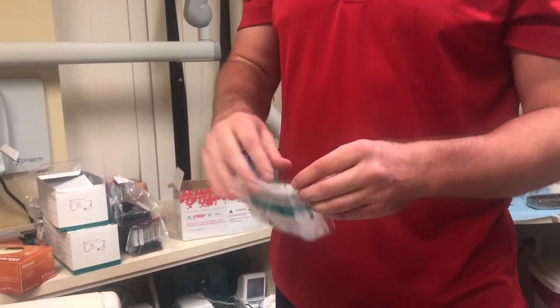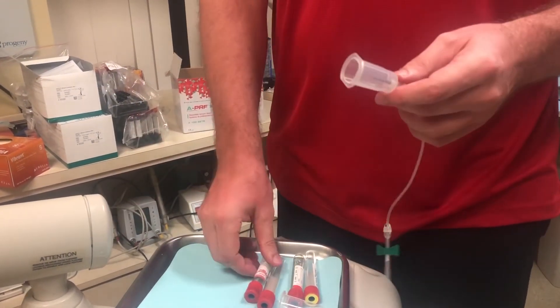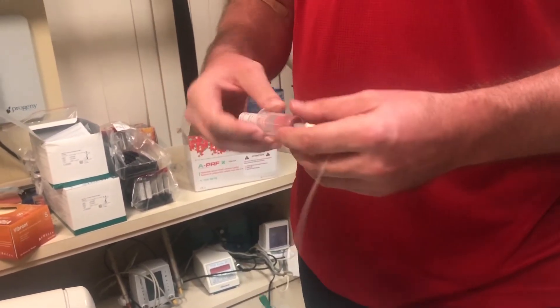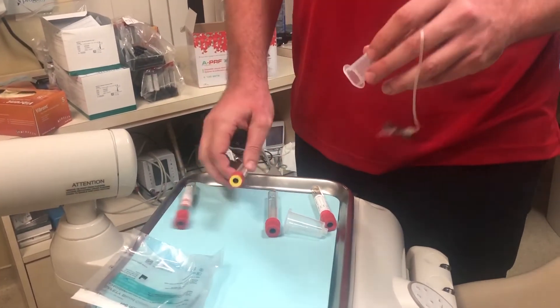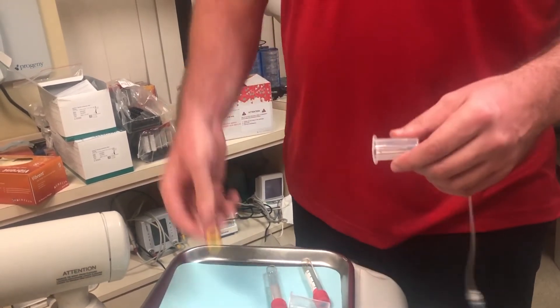These are the standard Vacuette butterfly needles that everybody uses. I just want to show people one thing — you'll notice that some of the tubes work very well, and with that company there you have to push a little bit harder. It fits nicely. These are the APRF tubes. These companies here go together, so this fits perfectly — it's an ideal fit.